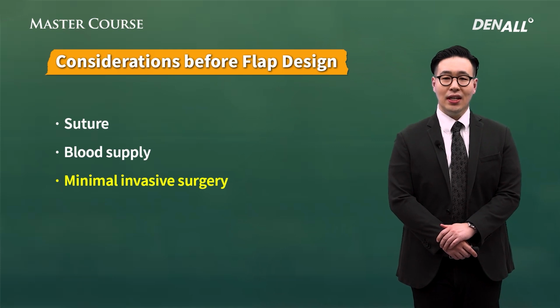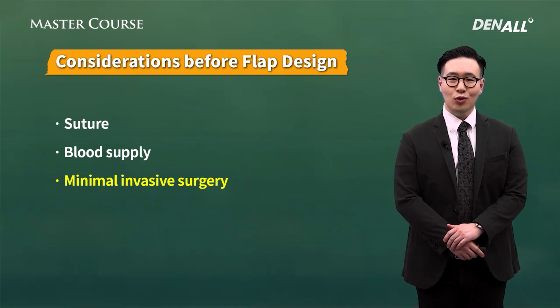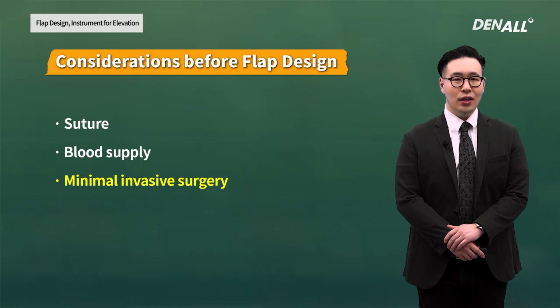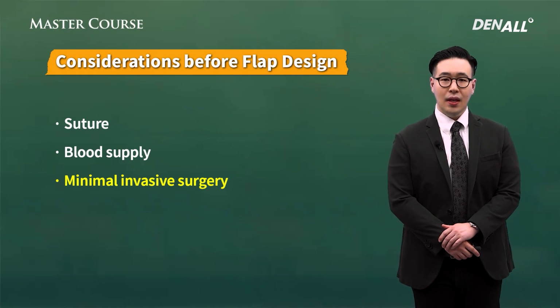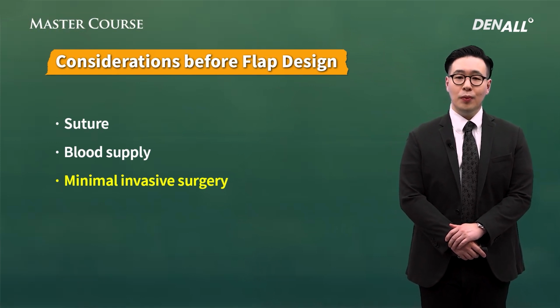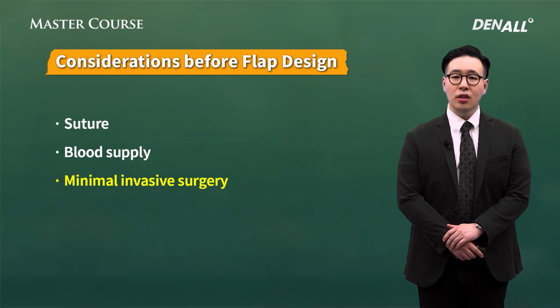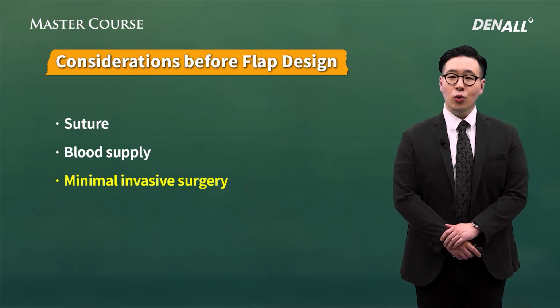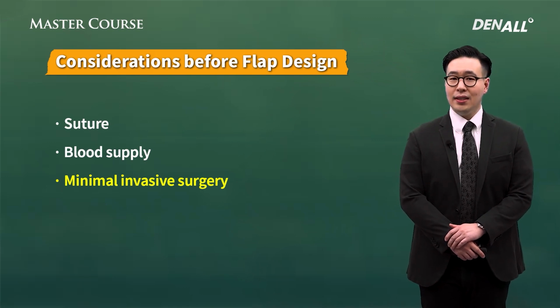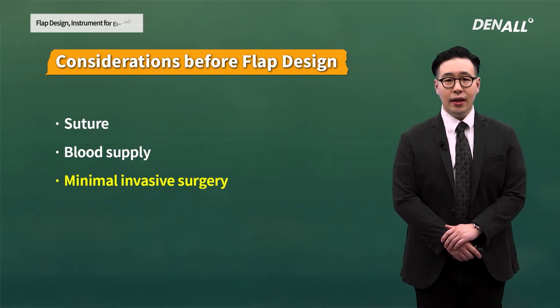If you make incision in the wrong position, no matter how advanced your technique is, it will affect the prognosis and healing. And I would like to say that you need to open flap thinking of how you're going to close it. If you're going to do ridge augmentation after flap elevation, you need to consider the fact that at times, due to releasing incision, blood flow to the flap becomes unfavorable. And this can lead to necrosis in the flap. Therefore, position of crestal incision is very important.